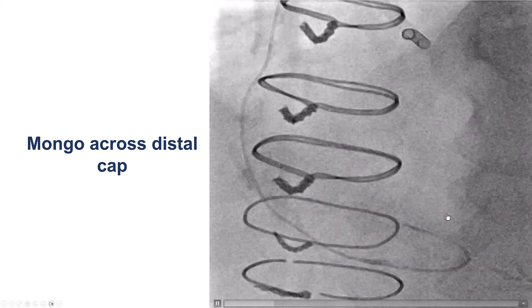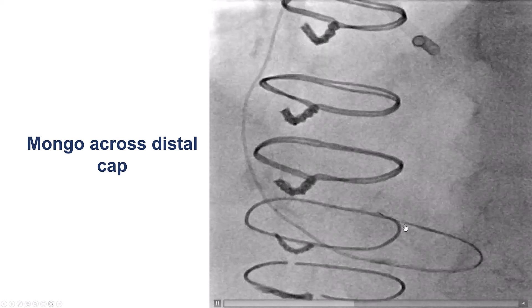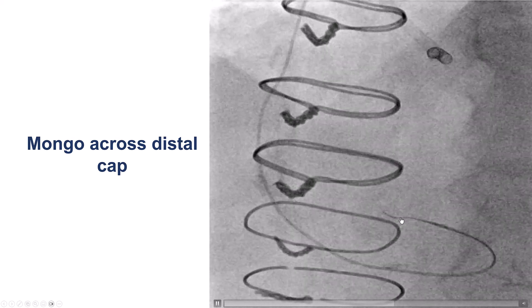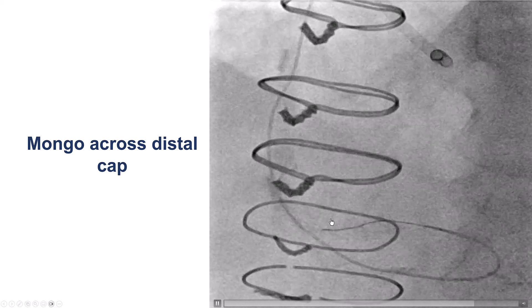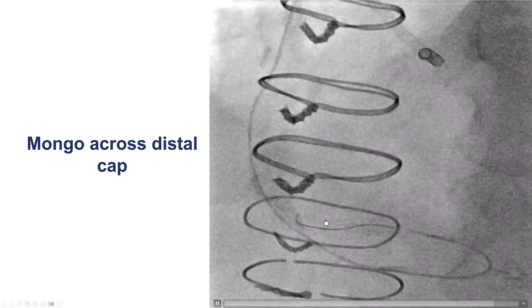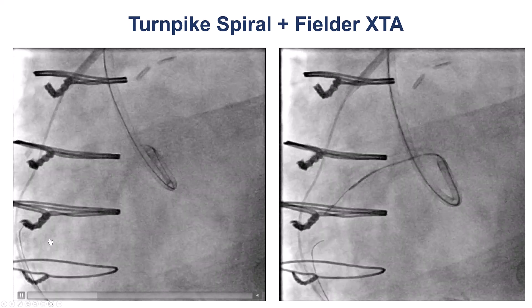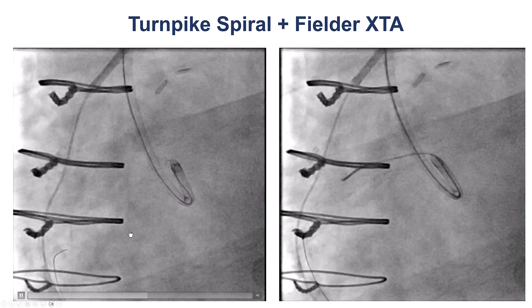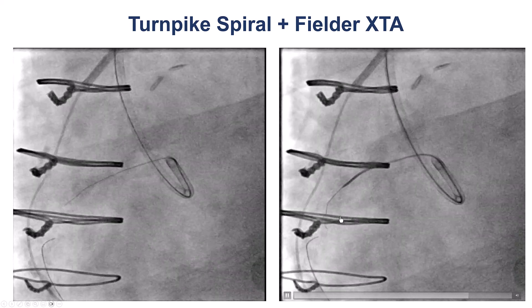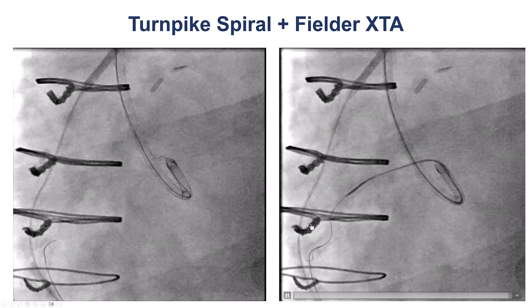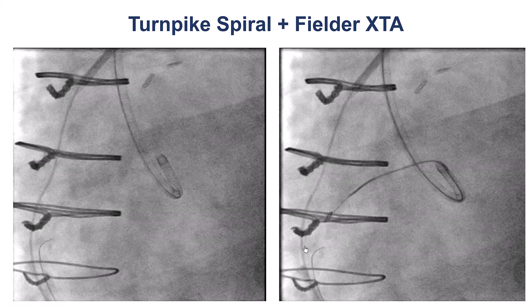We were able to advance the microcatheter to the distal cap. We then used the Gladius Mongo guidewire again, which was able to penetrate through the distal cap and is now moving along the distal right coronary artery. With the Mongo in the mid-right coronary artery, we came antegrade with a Turnpike Spiral and a Fielder XTA guidewire, which appears to be going extraluminal and is very close to the retrograde guidewire.